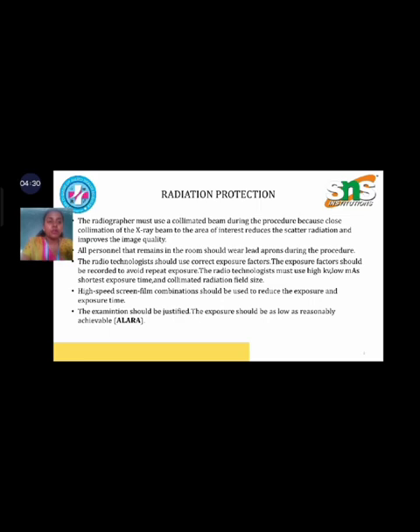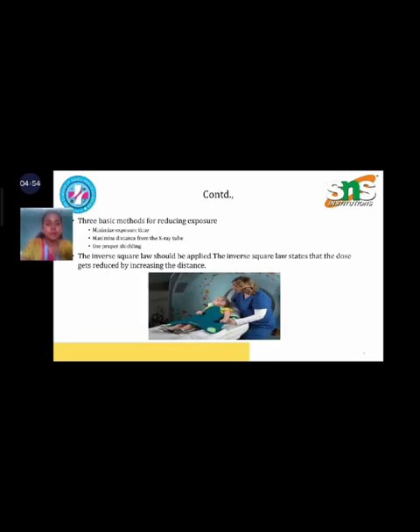The radiotechnologist must use high kV, low mAs, the shortest exposure time and a collimated radiation field size. A high-speed screen-film combination should be used to reduce the exposure and exposure time. The examination should be justified. The exposure should be as low as reasonably achievable, which is the ALARA principle.